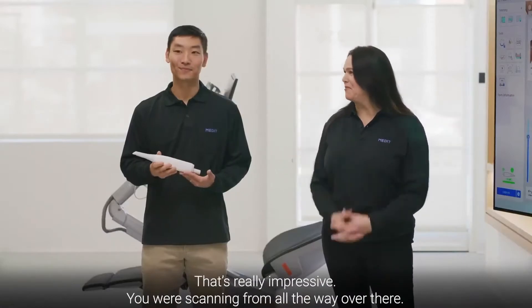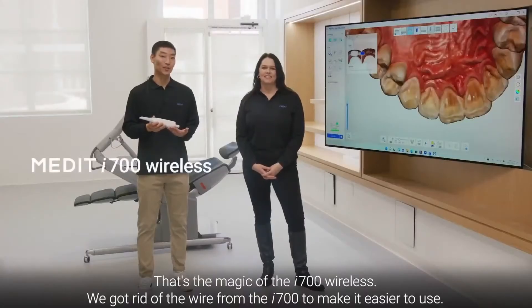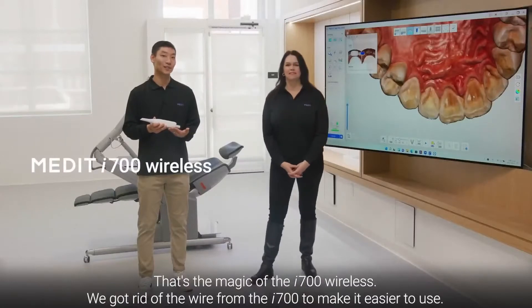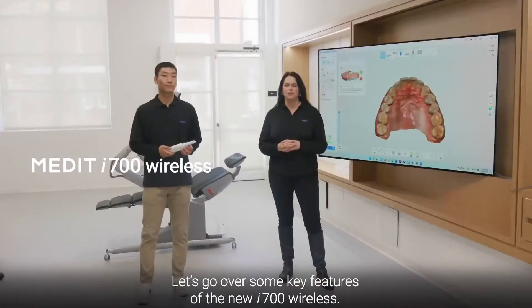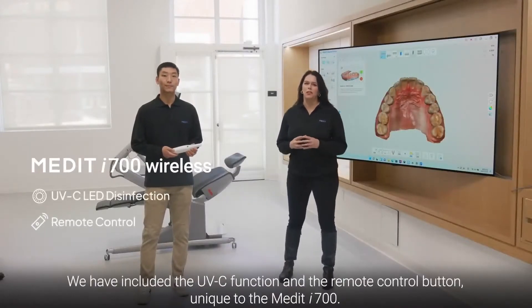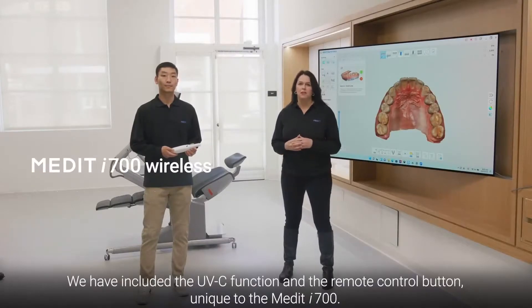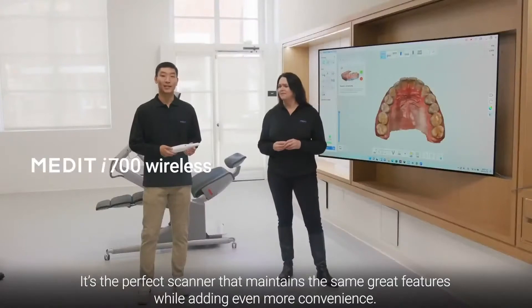That's really impressive. You were scanning from all the way over there. That's the magic of the i700 Wireless. We got rid of the wire from the i700 to make it easier to use. It has the UVC function and the remote control button unique to the Medit i700 — it's only the wire that's gone. It's the perfect scanner that maintains the same great features while adding even more convenience.